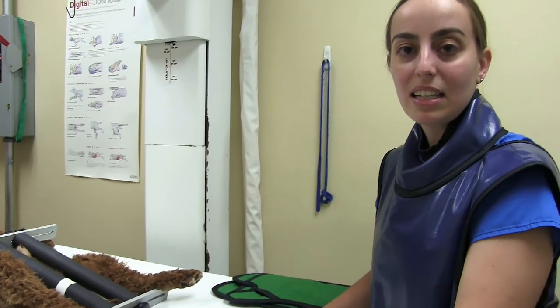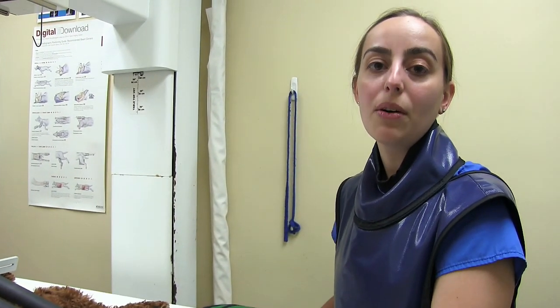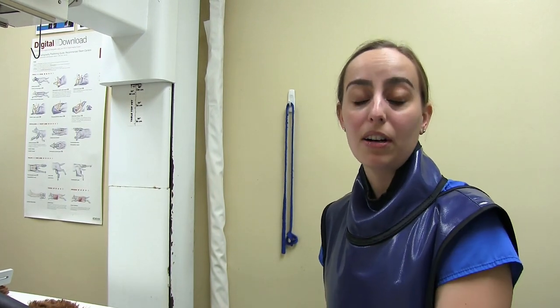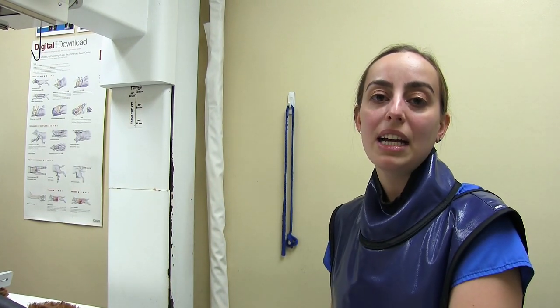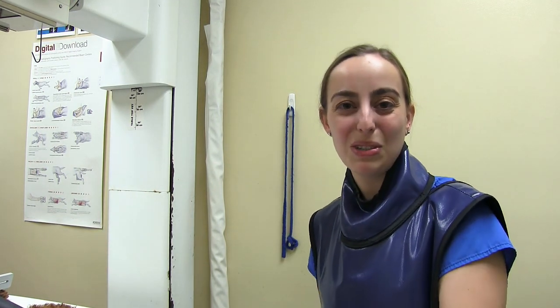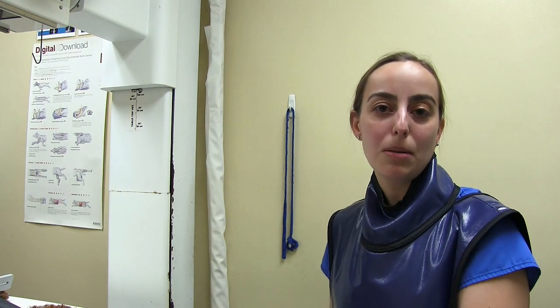That laxity lets us know what these hips look like, how likely this dog is to develop hip arthritis down the road, and what genetics it carries for hip dysplasia — expressed as a numerical value to apply to your breeding program.